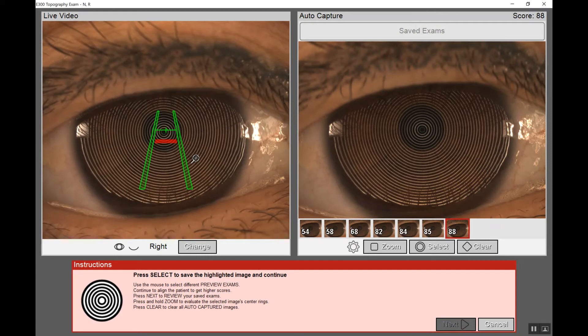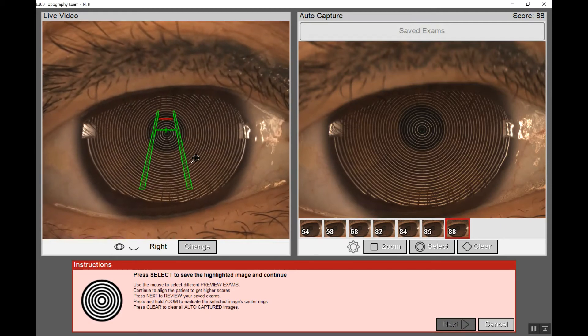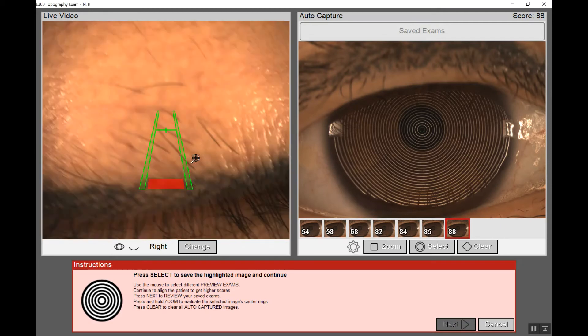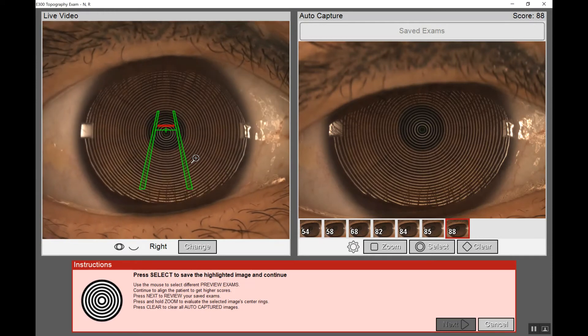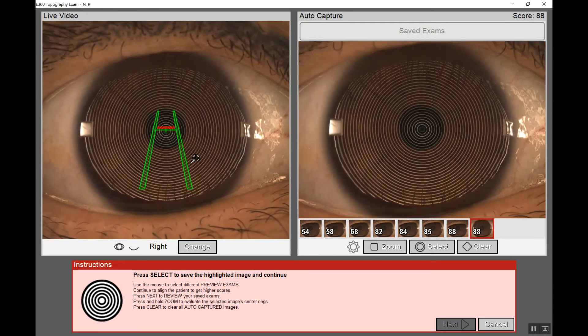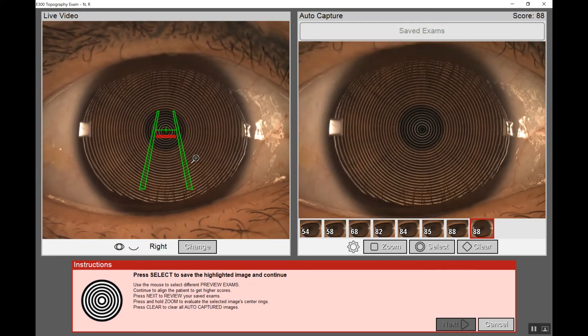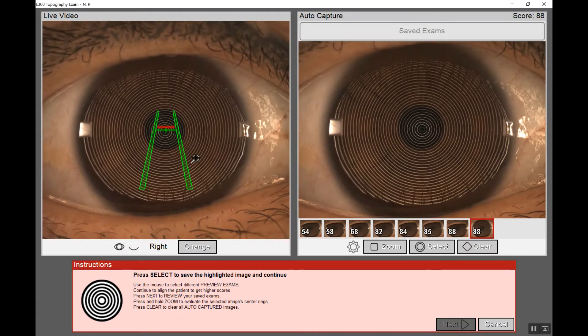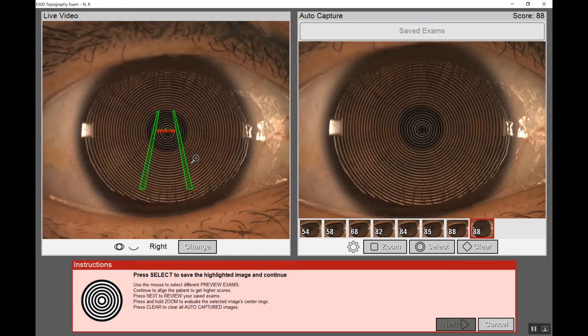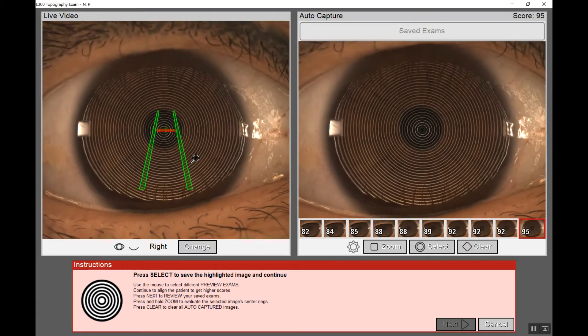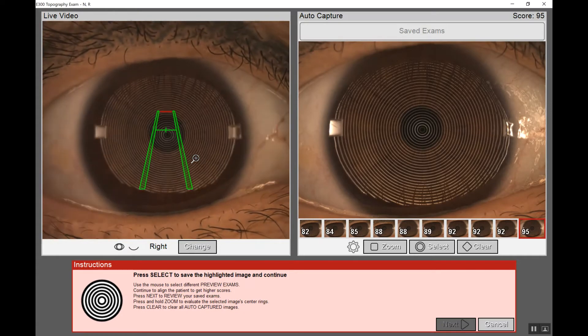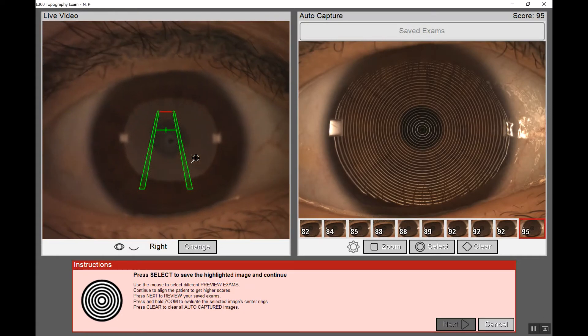So let's move it towards center, but ask our patient to blink and hold their eye open as long as they can. We'll try to get a capture within about four seconds. If not, we'll ask the patient to blink again until we're able to get a 90% confidence or better.